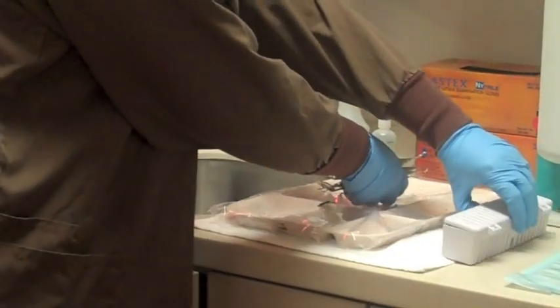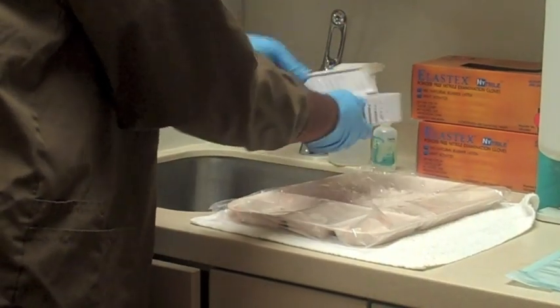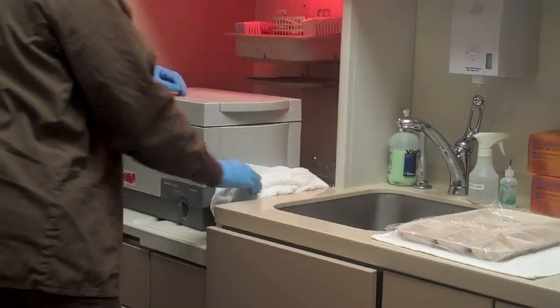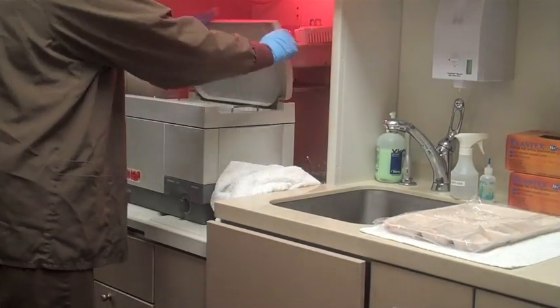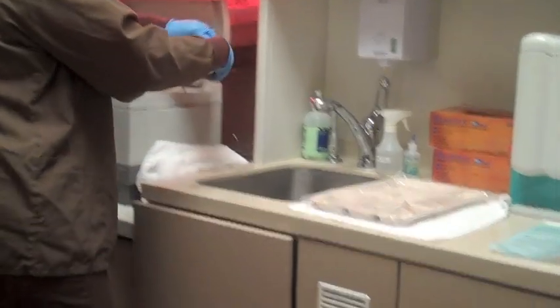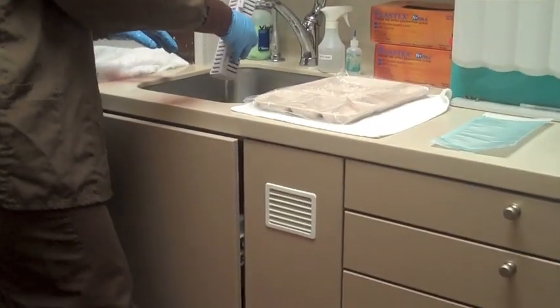Our sterilization process starts with taking the contaminated instruments and putting them in a basket. That basket is then placed into an ultrasonic cleaner. Once that ultrasonic machine has run its cycle, we rinse the instruments and place the cassette in a dryer.